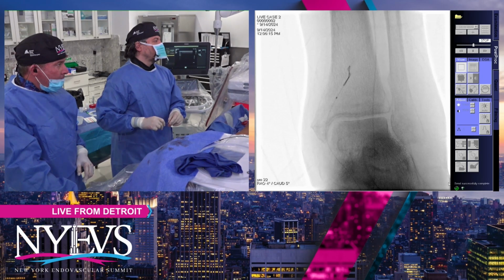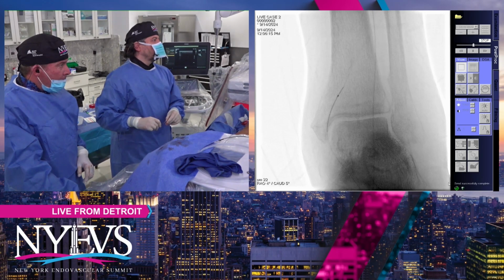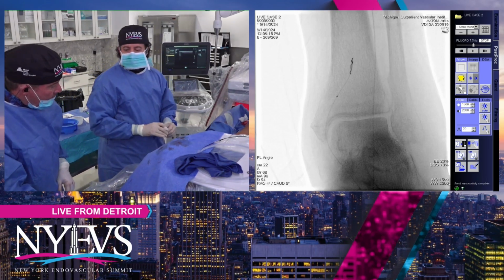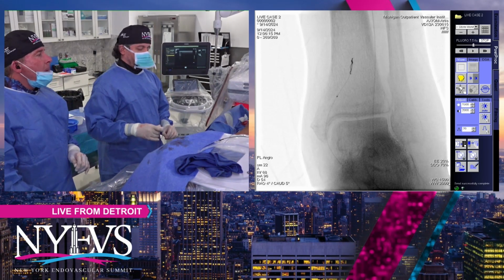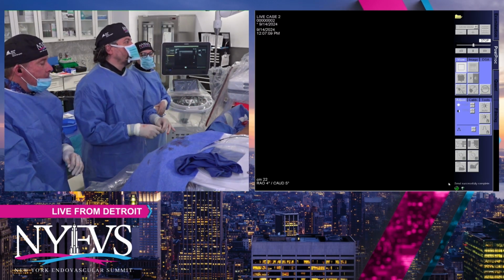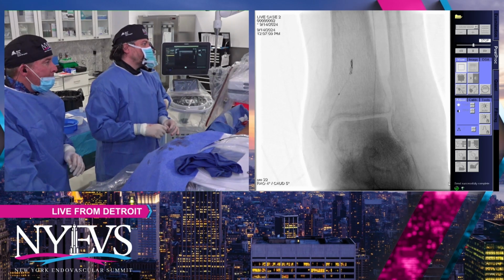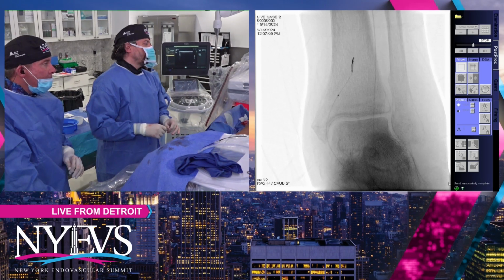Fadi, this is PK. Just a quick question. You're using the loop technique as you're dissecting. Just for the audience, are you worried about disrupting any of the circulation into the area you're trying to perfuse by maybe closing the collaterals? Hey, PK, great to hear your voice. That's a great question. What I'm doing right now is retrograde dissection. I'm not saying it's always safe or benign, but it's still retrograde dissection. Any blood flow coming to the area is going to be antegrade blood flow. So in theory, I'm not disrupting any of those antegrade vessels.